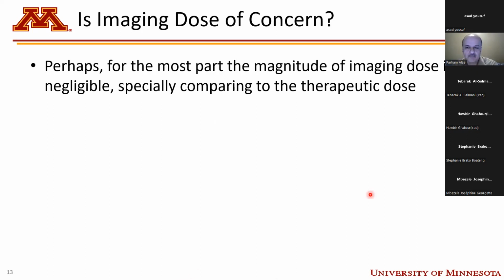For the most part, the magnitude of imaging dose is negligible. Especially, we treat a patient, these are cancer patients, we treat them to 50, 60, 70 gray. So the imaging dose magnitude, if you compare that to the therapeutic dose, is negligible.